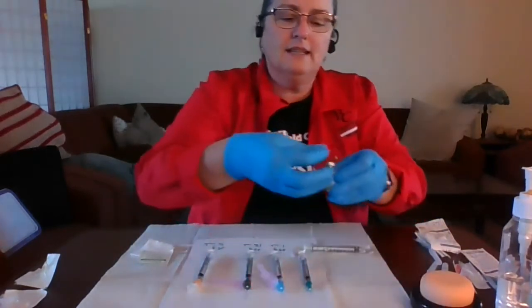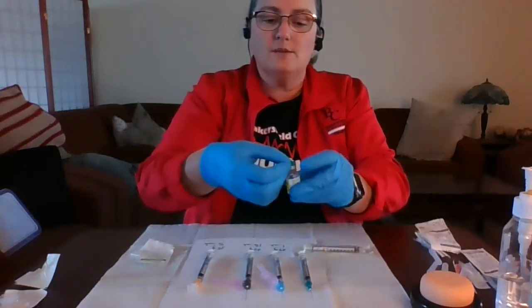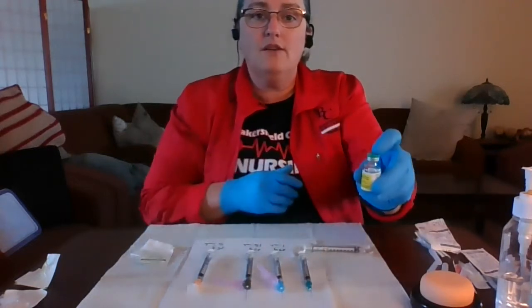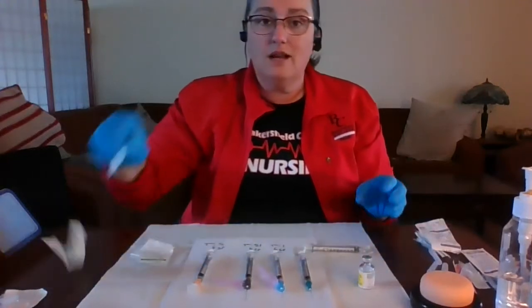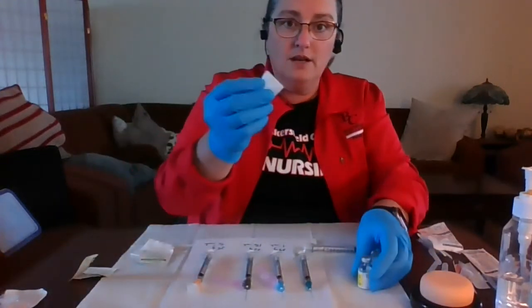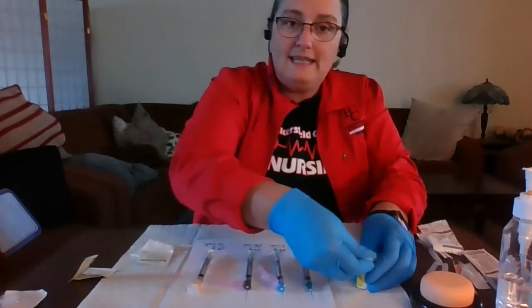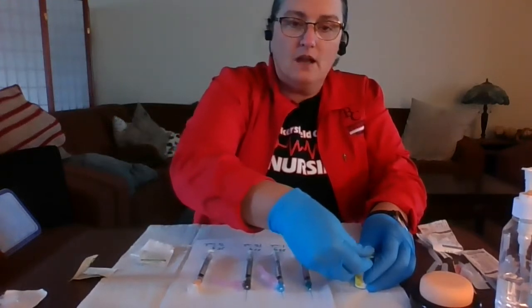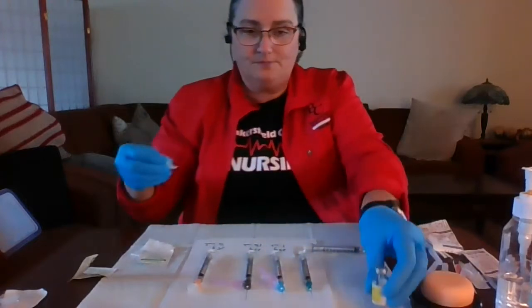Once you have taken the lid off that vial, our vaccines are coming in multi-dose vials, but once you've taken the lid off the vial, we want to make sure that we use a clean, unopened alcohol pad, and then we would clean the top of that vial in between each drawing up of each injection.